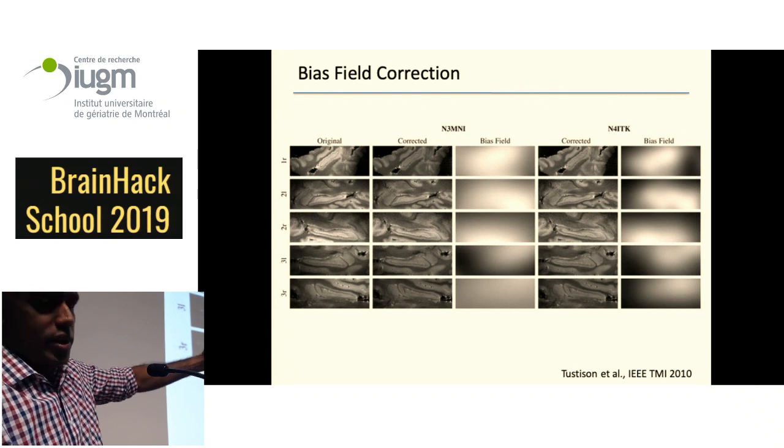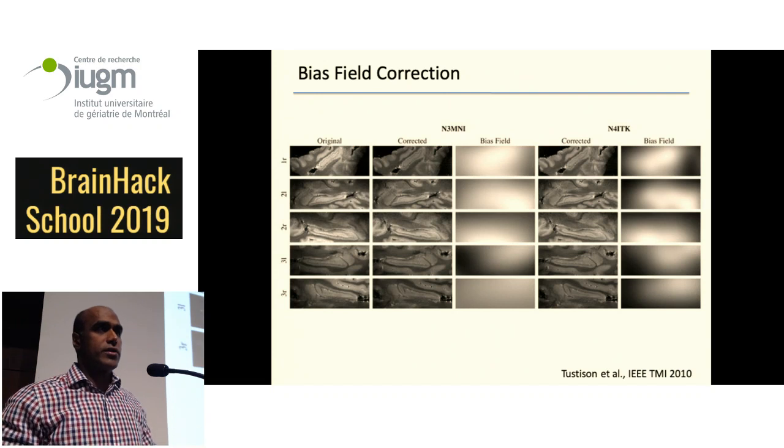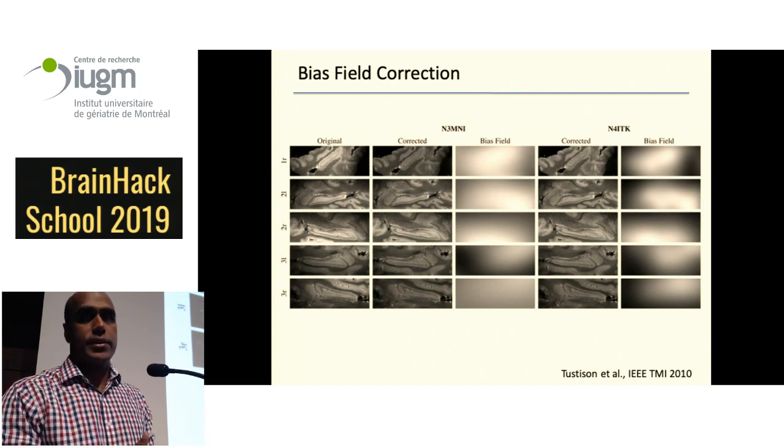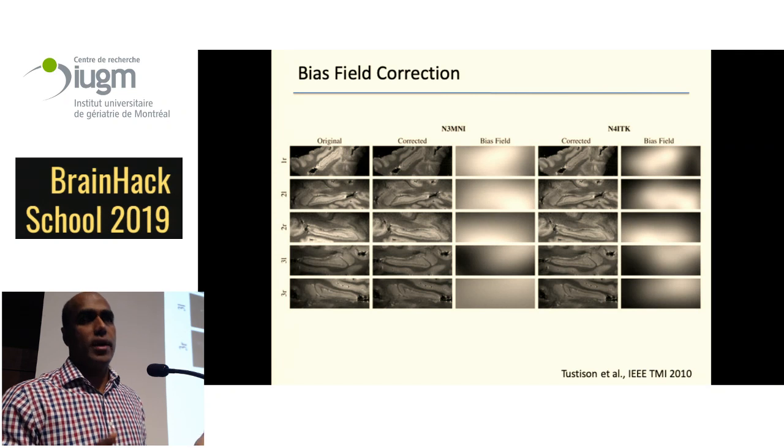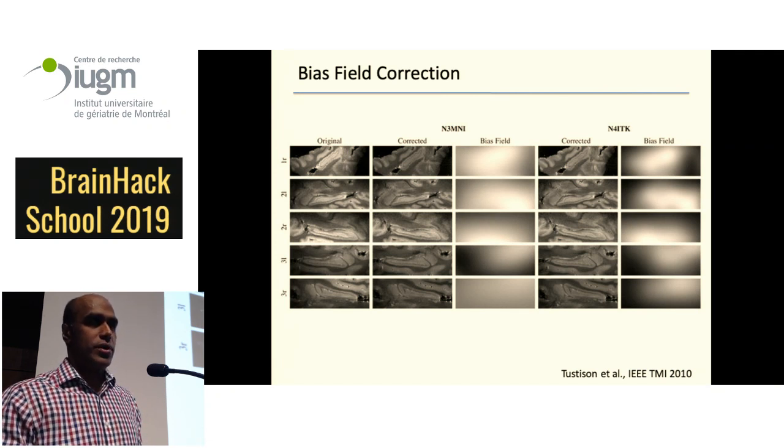And the idea is that, as I mentioned before, it really starts looking for overarching gross bias fields, and then starts trying to find more local inhomogeneities as it drills down, like you would in a nonlinear registration algorithm, for example, right? Does that make sense? Any questions about that?